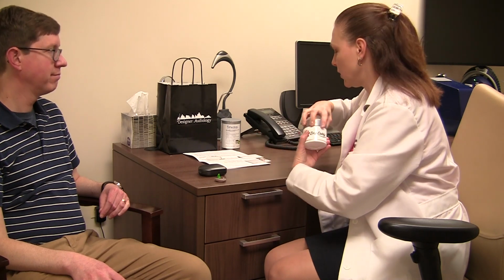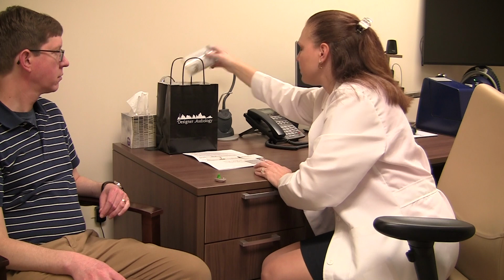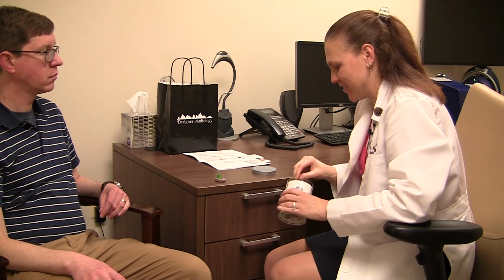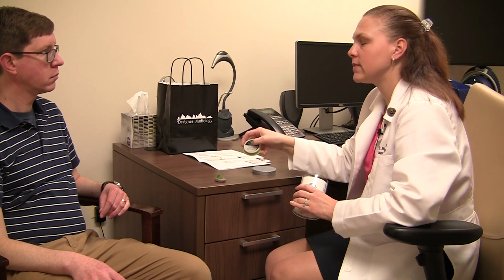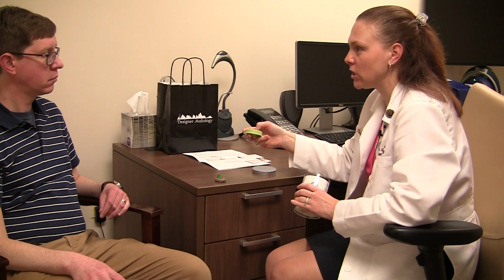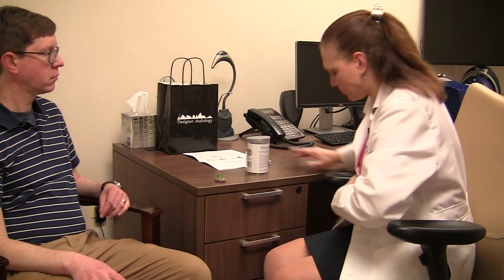Good so far? All right, so I'm going to put all these in here for you before I forget. Oh, I should mention the dryers, these little green discs, they have to be changed. I'll grab that for you. They have to be changed every 2 months. So when you take the foil off to activate it, some people will write the date that you activate it, some people will write the date that it needs to be changed, but you do need to change it, and this is your supply for the rest of the year.